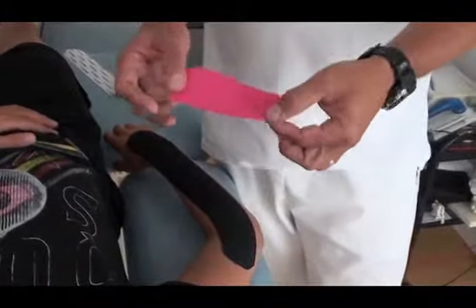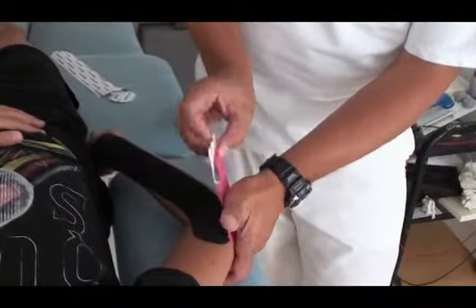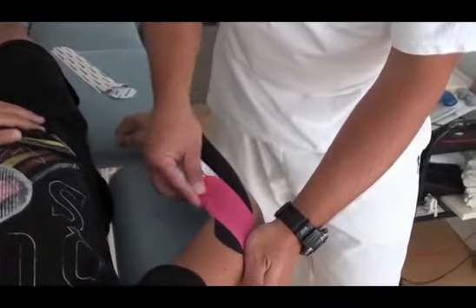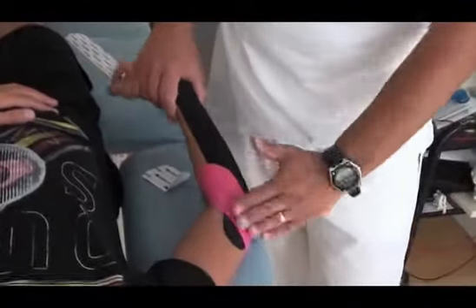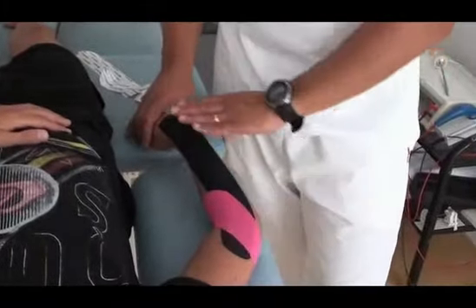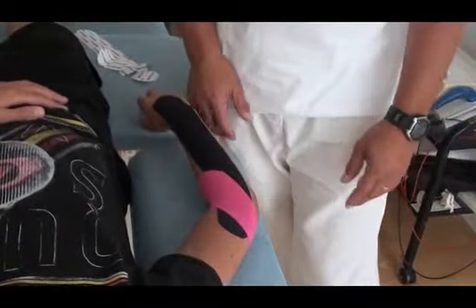So what we do, we take the next part, we crack it, pull, the paper goes off, we put it on like this, hold a little bit and just pull so you get the paper to come up. Take it out, so we leave 3-4 centimeters left. Hold the muscle, the fascia, pull it down and just drop it like this, and then just pull everything out. This is called correction technique. Now we have a perfect taping for tennis elbow. Muscle technique, which uses about 25% of the stretch, and correction technique, which uses about 75% of the stretch. This will give a good release of the pain for the patient.